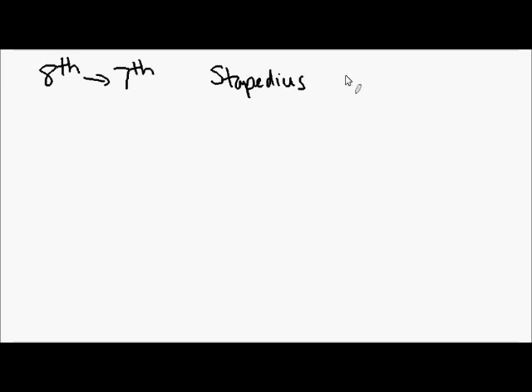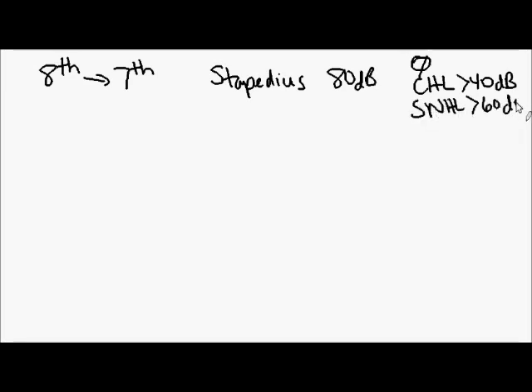Specifically, an 80 decibel tone is transmitted at 500, 1000, and 2000 hertz. A response is not expected if you've got a conductive hearing loss greater than 40 decibels or a sensorineural hearing loss greater than 60 decibels. Let's trace out the entire pathway.